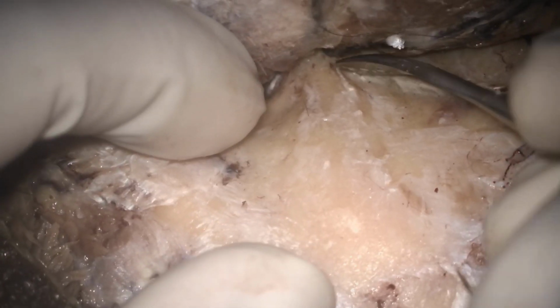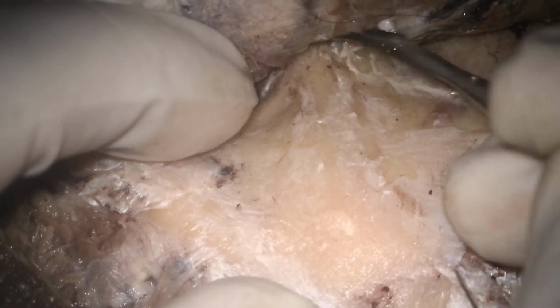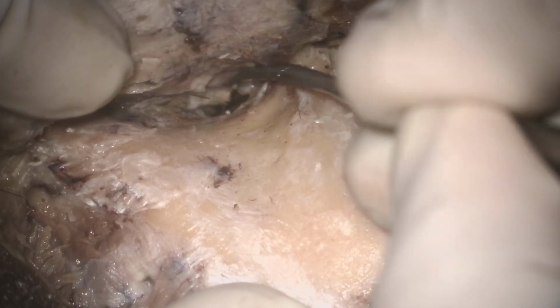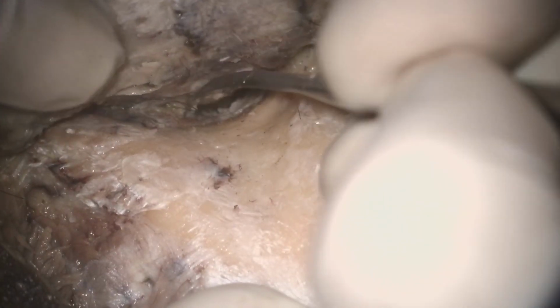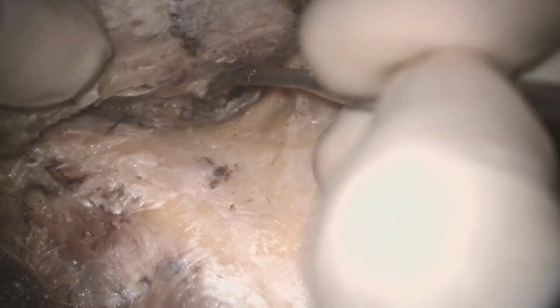Now look at the anatomical surface marking. What are the surface structures or anatomical landmarks that define the cortical area of the mastoid bone, or where is the actual location where you go through the cortical mastoidectomy? So this is the anterior part, this is the external auditory canal, this is the inferior part, this is the superior part, and this is the posterior part. Okay, so orient yourself. This is the superior, this is the inferior, this is anterior, and this is posterior.